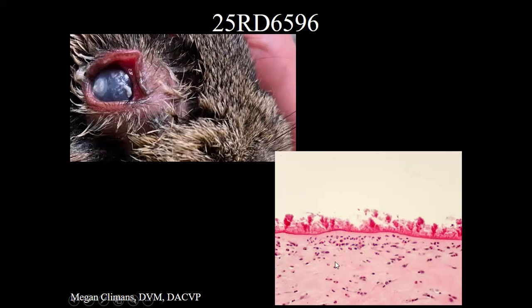And then here is a histologic view of a cat cornea. The stroma is down here. We're totally missing an epithelium. This is an area of ulceration. In the stroma, we have these lovely pink granulated cells. So these are eosinophils infiltrating the stroma with this bright eosinophilic material over the top of this tissue, which probably involves eosinophilic basic protein, at least. And this gross and histologic presentation is pretty pathognomonic for a certain entity, especially seen in rabbits and cats.